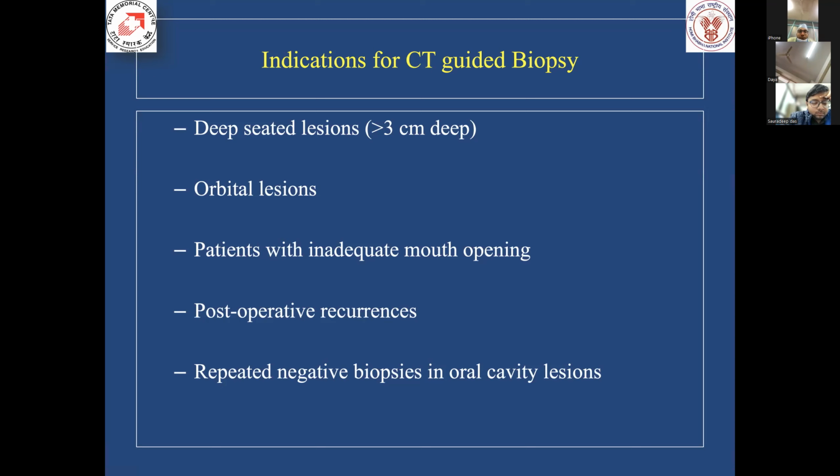Those patients who have inadequate mouth opening and the surgeons are not able to take the biopsies, again, ultrasound would not be the modality. This is where CT scan is used. Post-op recurrence, because of the limited window that is available on ultrasound, again CT is a better modality. And when multiple biopsies are coming negative even after doing it under direct vision, that is when we take a deeper biopsy using CT guidance.